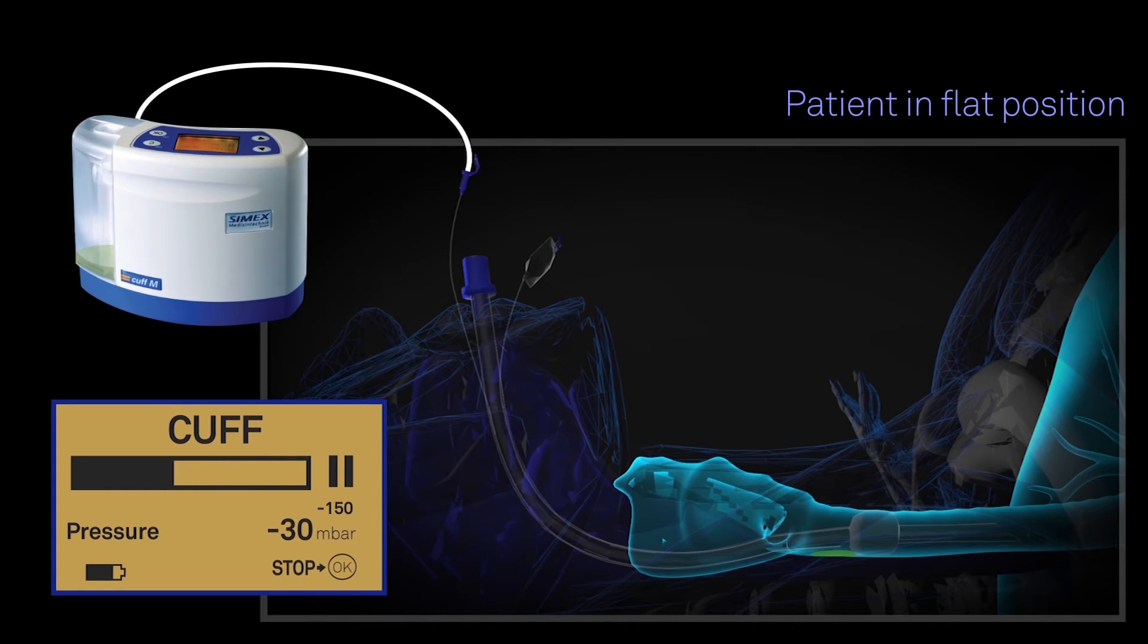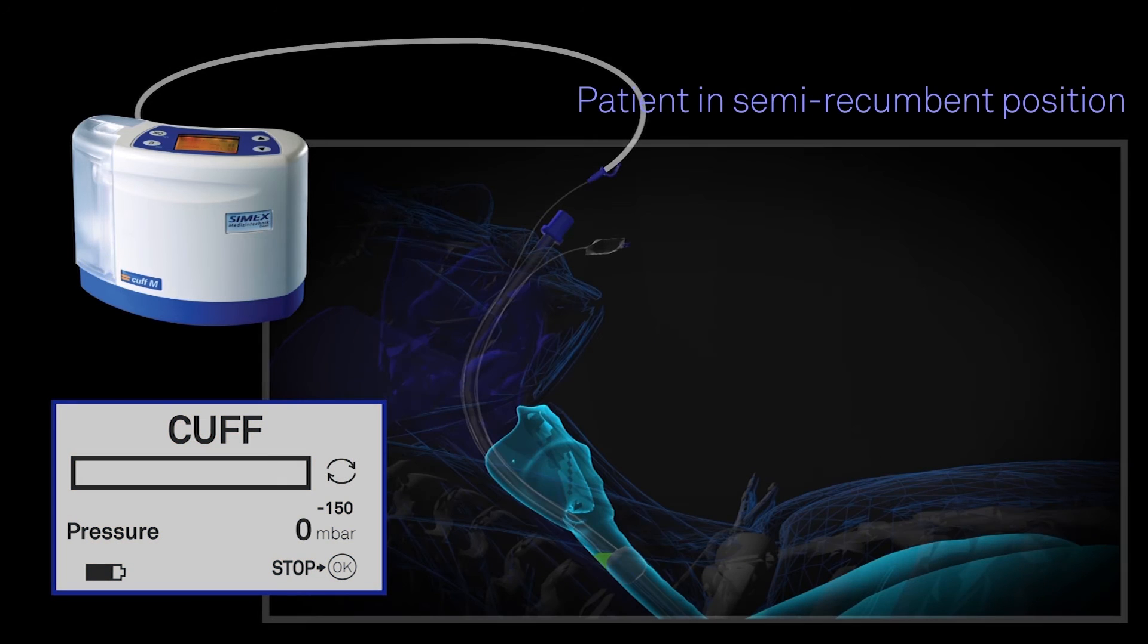Secretions are then aspirated from above the balloon cuff as shown, regardless of whether the patient is in a flat or semi-recumbent position. Notice that during the aspiration phase, normally 12 to 15 seconds in duration, the secretions are removed and collected in the canister.